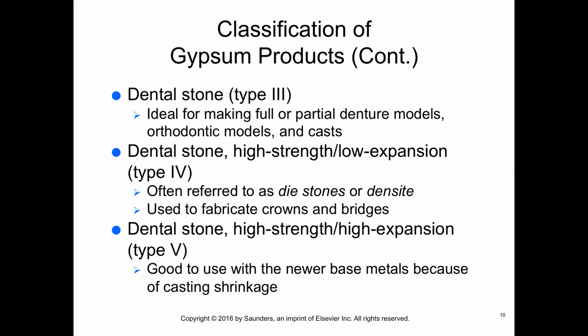Dental stone type 3, which is usually colored yellow or white, is usually used to make an appliance such as orthodontic retainers, whitening trays, sports guards, and partials. It has a uniformly shaped, relatively non-porous crystal and requires less water to mix, making the material more dense. It's approximately 2.5 times stronger than plaster.